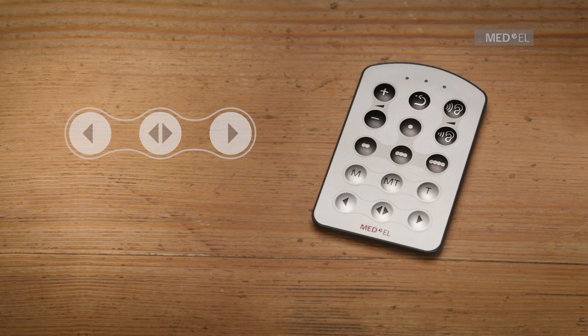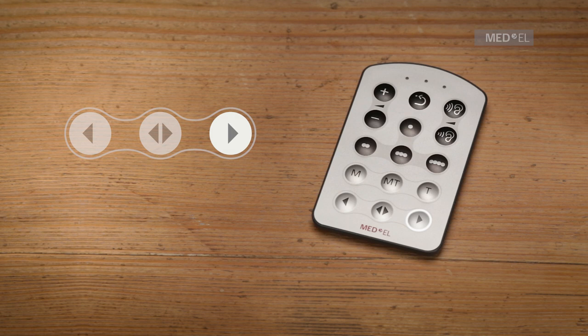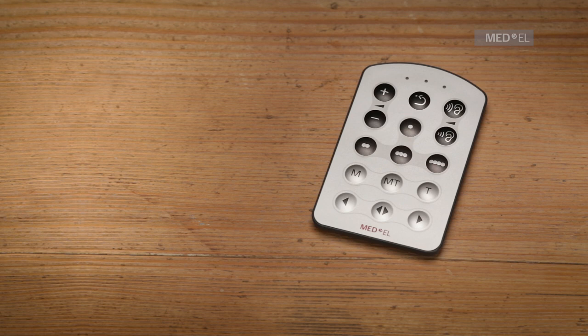Then hold down the right arrow key to activate the automatic keyboard lock. The fine-tuner will confirm successful activation of the automatic keyboard lock by a short blinking signal of the two amber indicator lights.